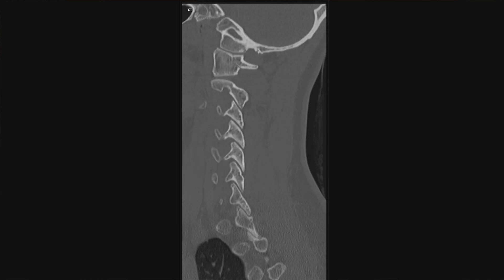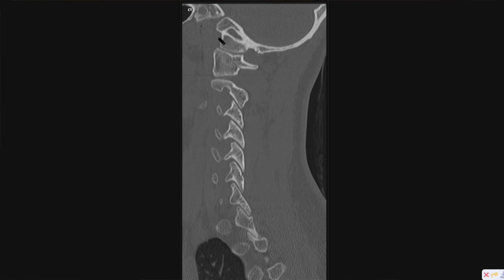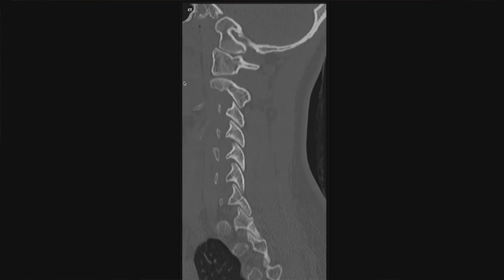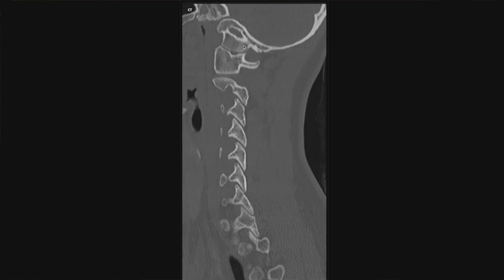I then scroll laterally and look at the occipital condyles. The occipital condyles are up here, kind of an extension of the skull, and they articulate with C1. This is the atlantooccipital joint. The normal distance between the occipital condyle and C1 is 1.4 millimeters or less. Anything wider than that and you have to start worrying about injury. Then I scroll to the other side and do the same thing, making sure that measurement is 1.4 millimeters or less.